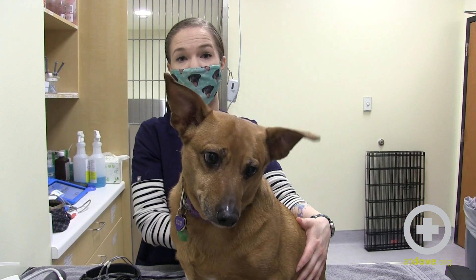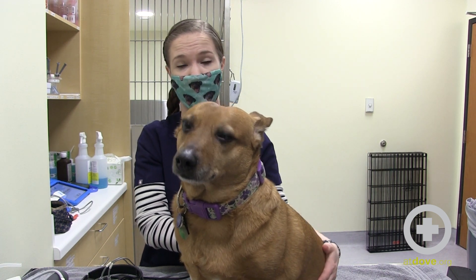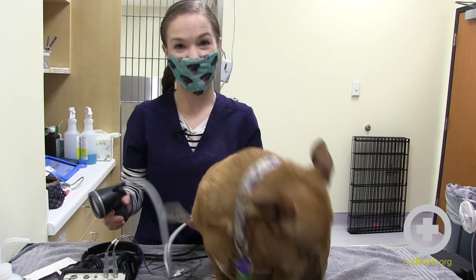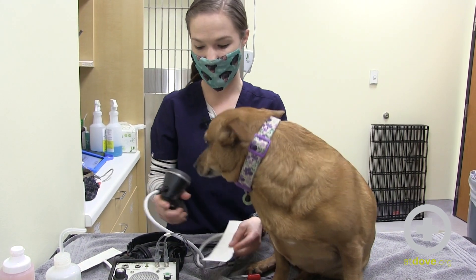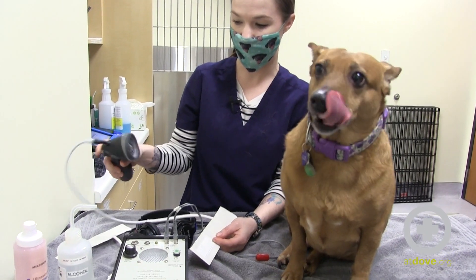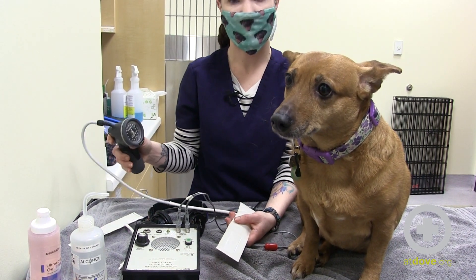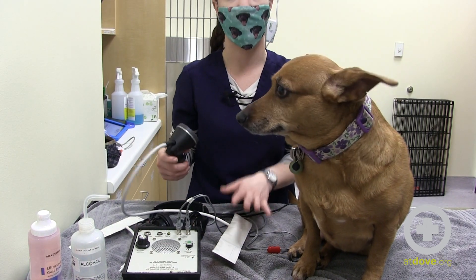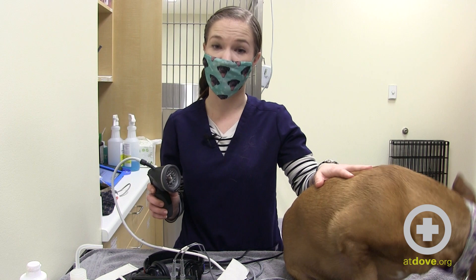Another issue we commonly have is if the blood pressure is too quiet or drops way too quickly, and we're not able to get an accurate reading. That can be a couple of things. There may be a hole in the cuff or in the line of the spig. To test that, use the little lever — if you squeeze it and it doesn't maintain and drops down really quickly, there's something wrong. You can switch out your cuff and try again; if you're still having an issue, switch out your spig and try again. But if the line is going down without you even squeezing to release it, there's something wrong with your equipment and you're not going to get an accurate blood pressure.